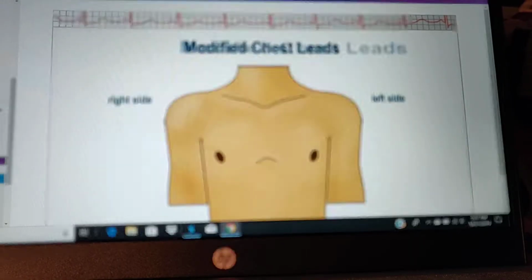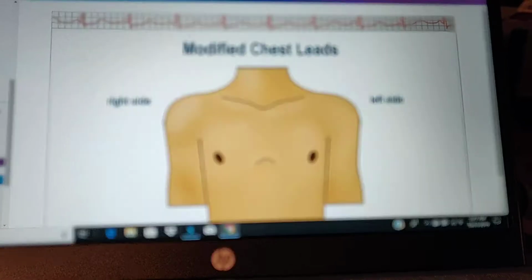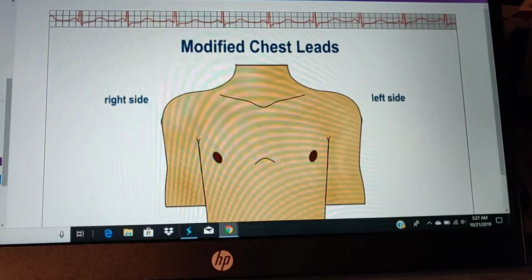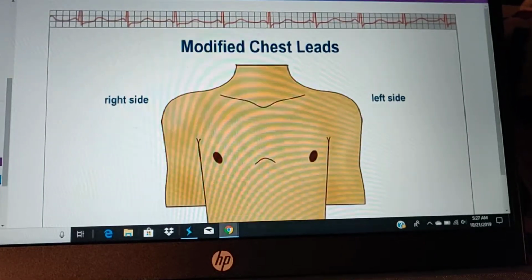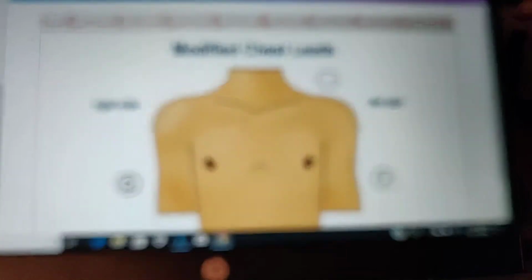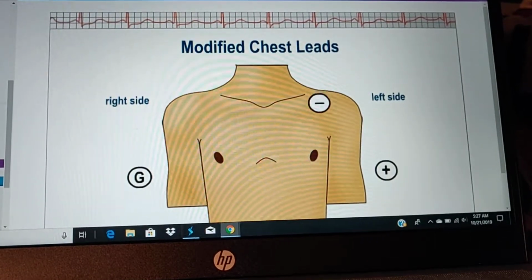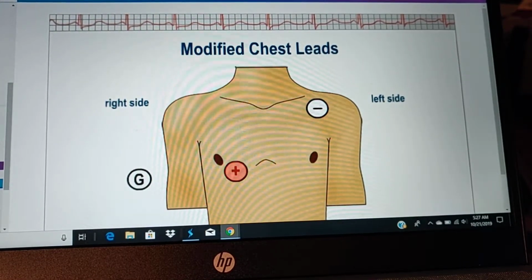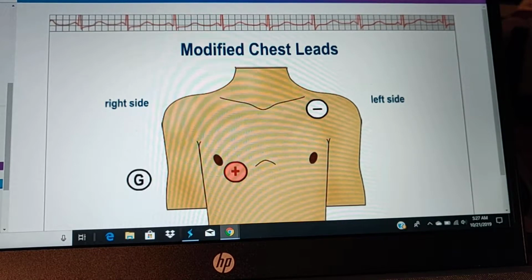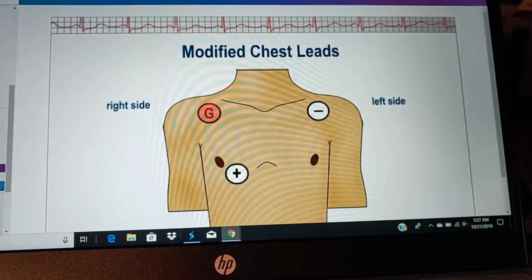The modified chest lead, MCL1, looks at the anterior wall of the heart. It can be used to best assess QRS complex arrhythmias. The negative electrode is placed on the left upper chest, the positive electrode on the right side of the sternum at the 4th intercostal space, and the ground electrode usually on the right upper chest.